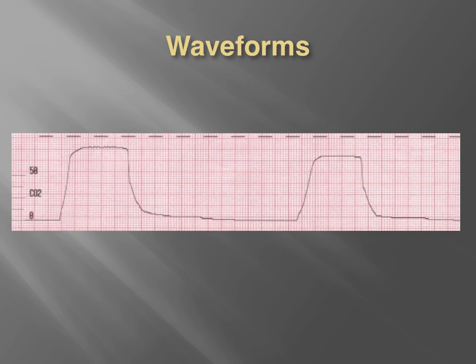So here's a bit of a different scenario. If we just figure this was a 10-second strip again, which it very well may not be, but actually it's probably less than that. This is really more of a hypoventilation. So this rate may actually be under 6 per minute.